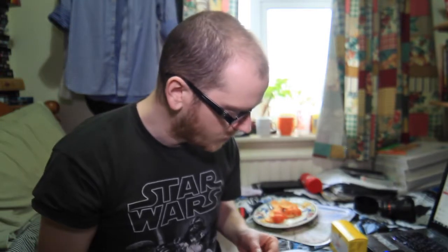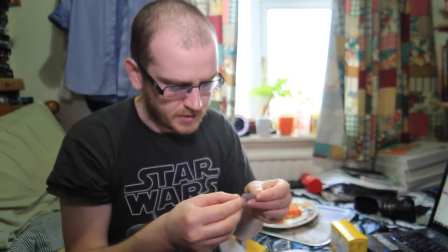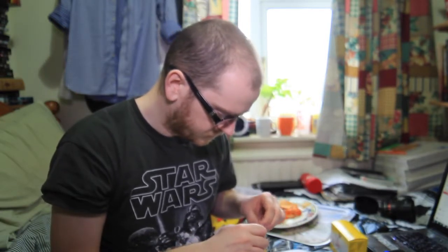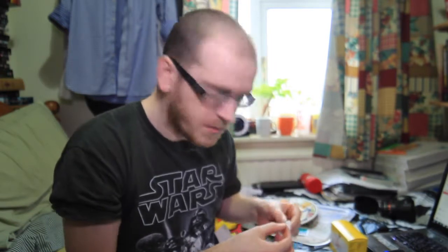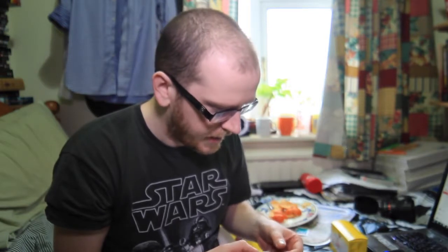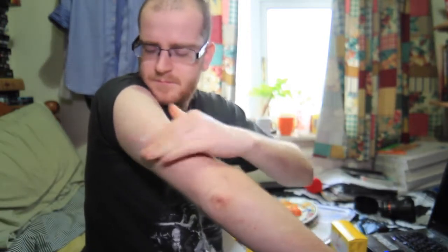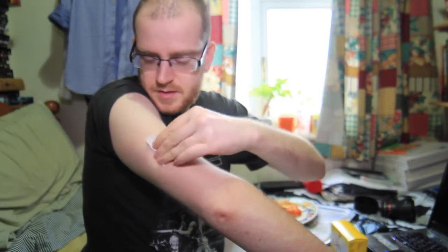Step two: clean the site with an alcohol wipe and allow it to dry before proceeding. This is the alcohol wipe — let me just tear this open and give it a wipe. I'm going to put it on my right arm because I'm left-handed, so I can swipe more easily with my left hand when I'm out cycling. It smells quite strong — this is probably the first alcohol I've had in years since I don't drink.